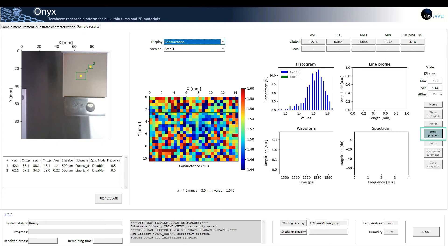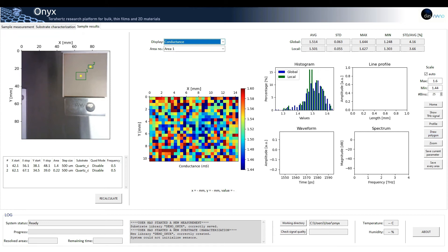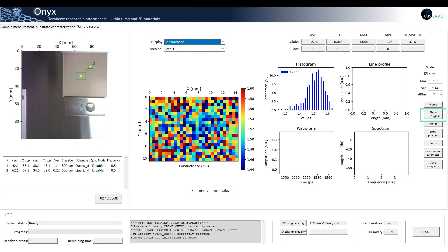As with the substrate, the user can draw a polygon on the sample map and the software will calculate the local conductance statistical values for this area. If the user wants to perform a detailed analysis of the THz signals involved, it is also possible by clicking show THz signal on the sample 2D map.